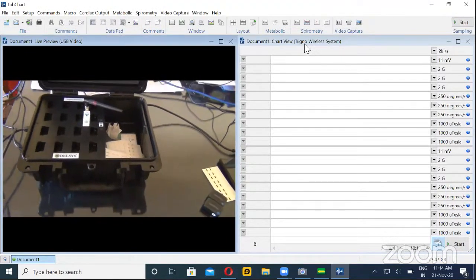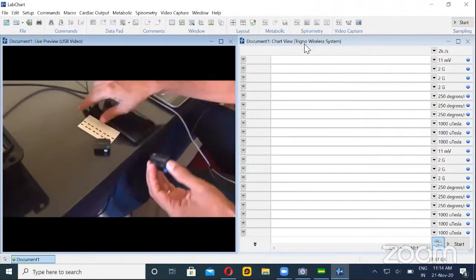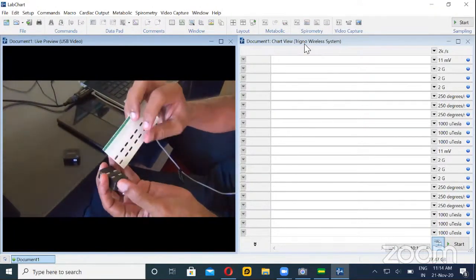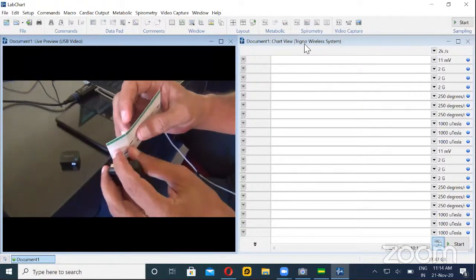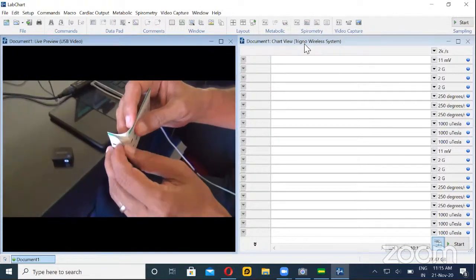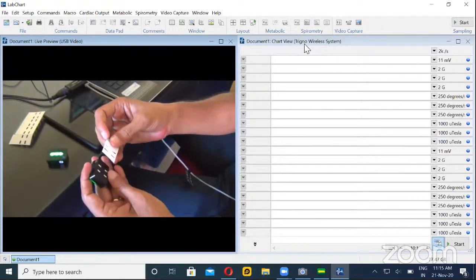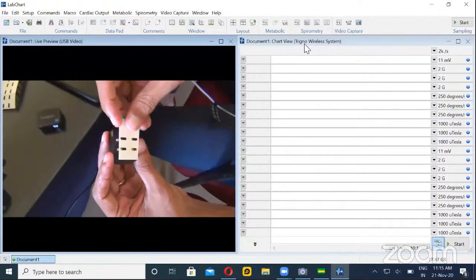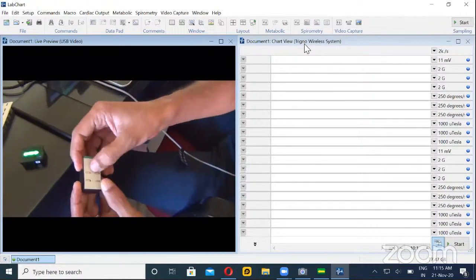Now you can see the base station and the sensors. These sensors have a sticker on them — a double-sided sticker specially made by the Delsys system. I will now show you how to attach the sensors. I remove the sticker and these are the contact points — they have to come within these holes here, and this is how you stick it.